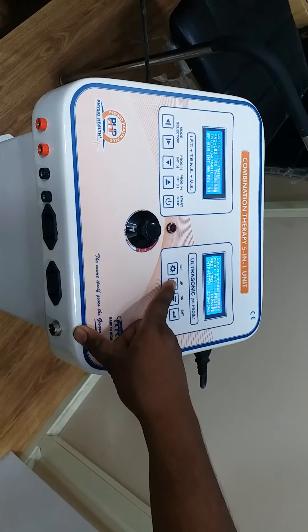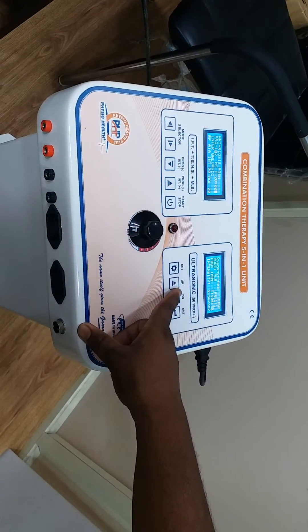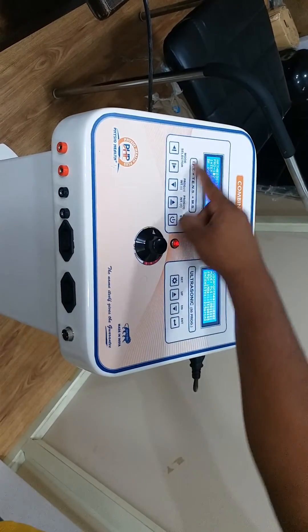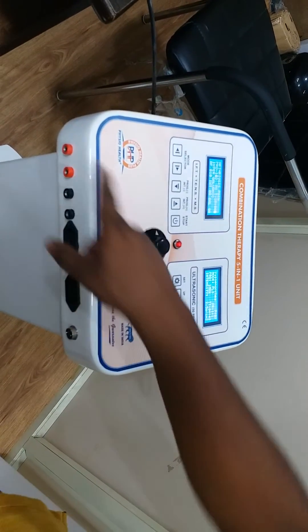You can also select the TENS machine. At a time, you can select three parts of the machine: this section, this section, and this section. Here is the output indicator.